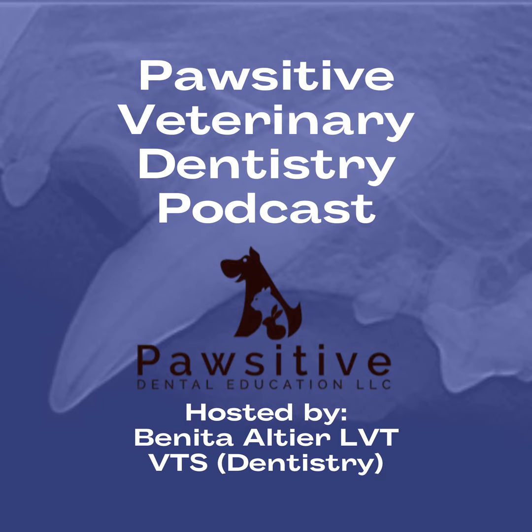And now we have even more advanced diagnostic imaging that also helps us provide more of the 3D image of the structure. Dental radiographs, I believe, are very affordable for general practices, and they are very, very helpful to give you more information as to how you can treat and practice a higher standard of care, more than just wiggly tooth dentistry. And I think that is where it helps.